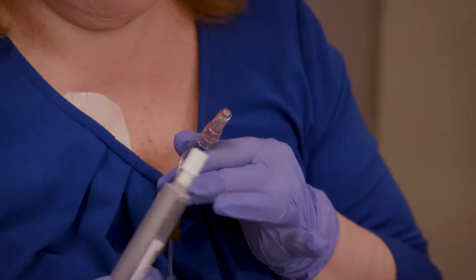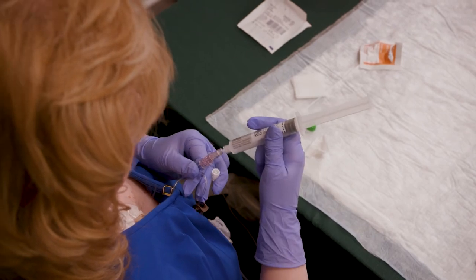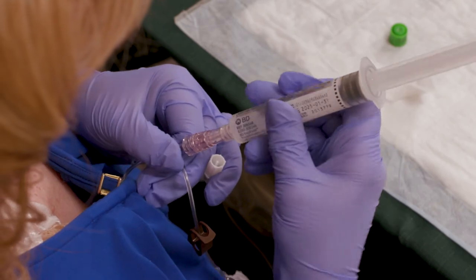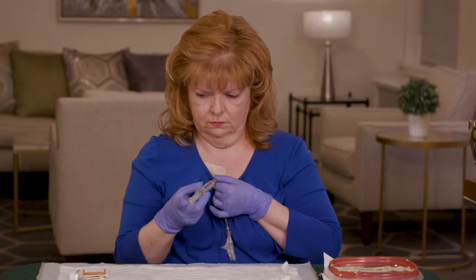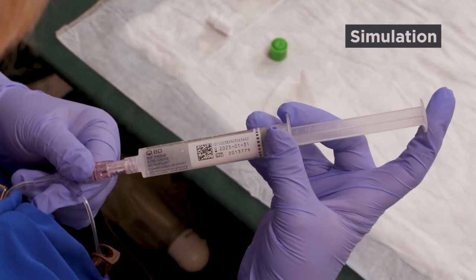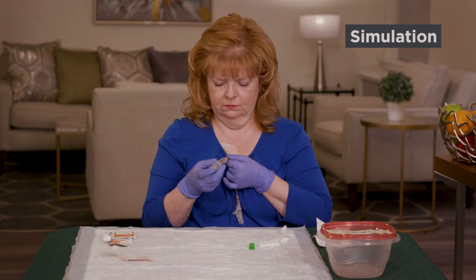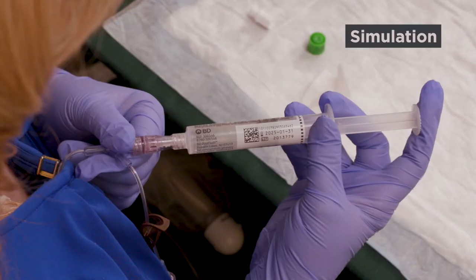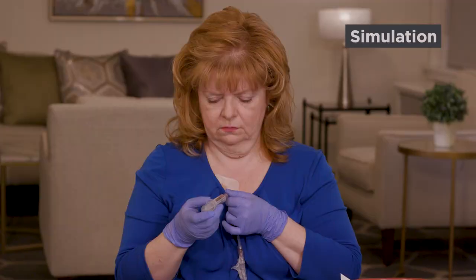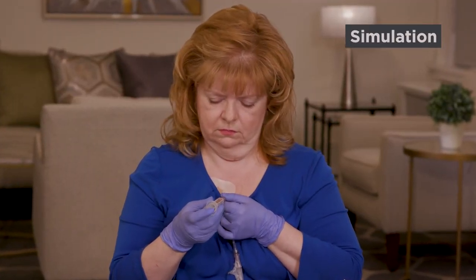Connect the syringe to the needleless connector by pushing it in and turning it to the right. Once it's connected, gently press the plunger to push about one-third of the saline from the syringe into the tubing, then pause. Push the next third into the tubing and pause again. Then push the rest of the saline into the tubing.